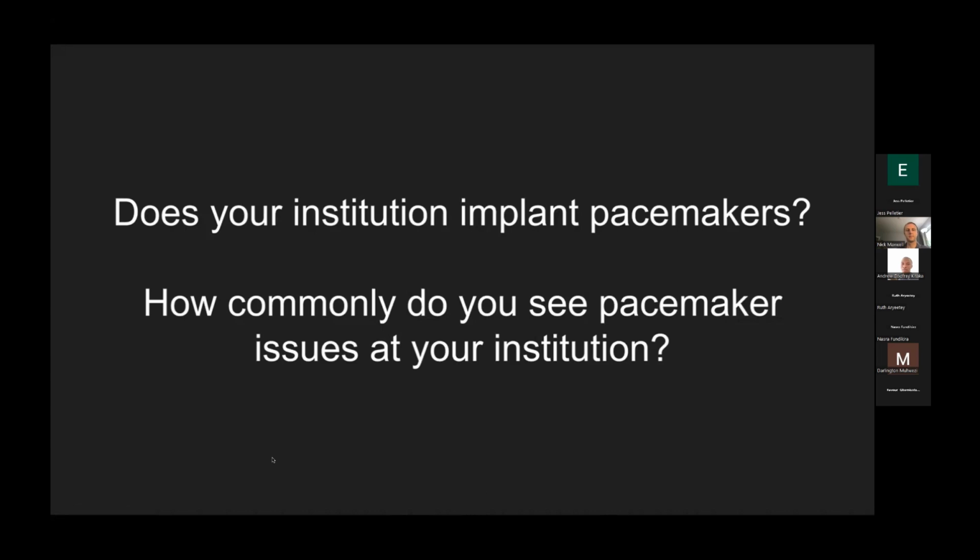Then pacemaker and imaging modalities are things that we must marry side by side. Yes, the X-ray is very, very important. You've talked about dislodgement, fracture, etc. But in the case of CTs, MRI, and other neuroimaging modalities, what are the issues? These are some of the things that are going to help practice and help people preparing for exams, maybe ABEM or something.